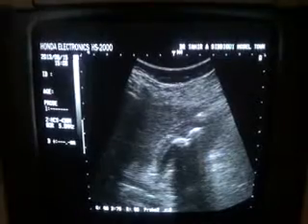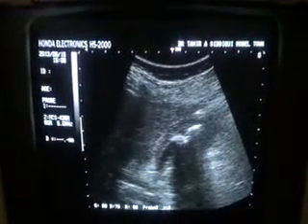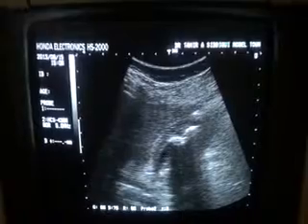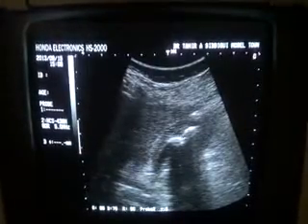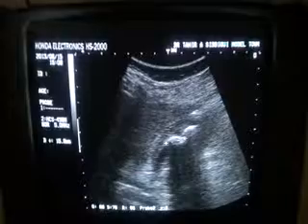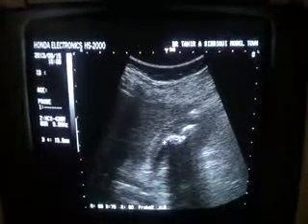Now this is the anterior wall of the gallbladder and these are the calculi with sharp posterior shadow obscuring the posterior wall, and this is the posterior part of the gallbladder. The body contains large calculi. The largest is 15.9 or 16 millimeters.